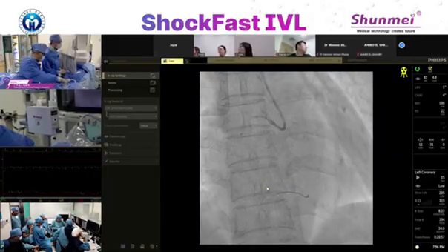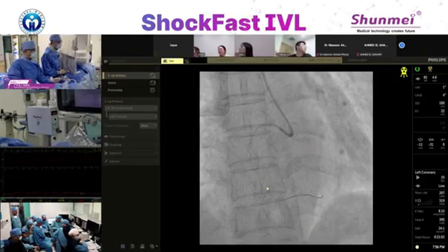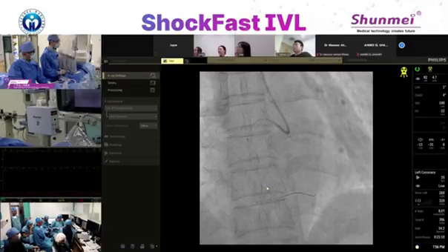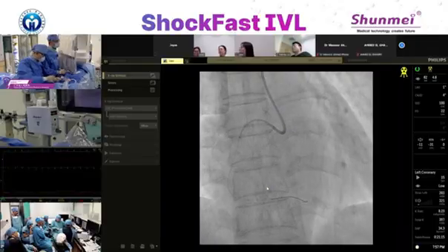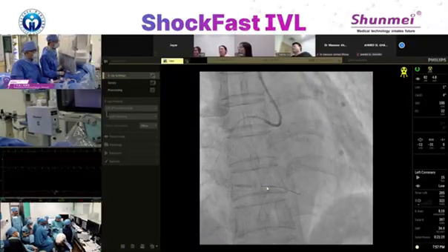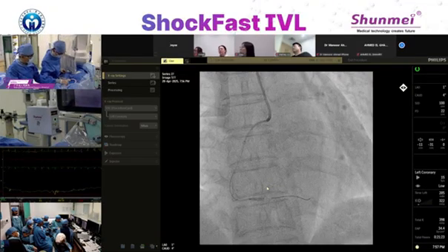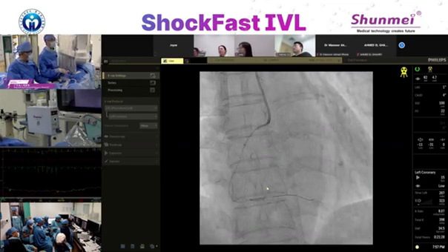It's going down. Going down. Come on, come on. Okay, seems here. It is at the position. Okay, inflate. 4. Release the tension, record it. Okay. Double hit. Now it's shocking.